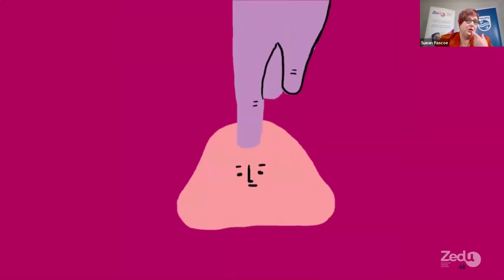You don't want to push too hard, because the testicles are slippery little suckers and they'll slide about everywhere. And if you're pushing too hard, not only can it be uncomfortable, but just imagine it, guys, it's like a mammogram. Maybe not. But if you push too hard, they'll just spread away and move away from the probe. So again, it's really important to use a feather-light touch. You want to balance the probe on the gel without pushing or dispersing the gel out of the way. So you need to use lots of gel so that you can maintain contact, but just balance your probe on top of the gel without squashing them.